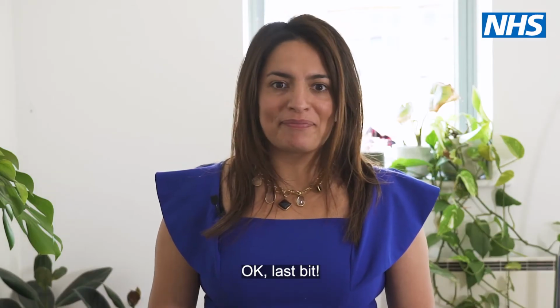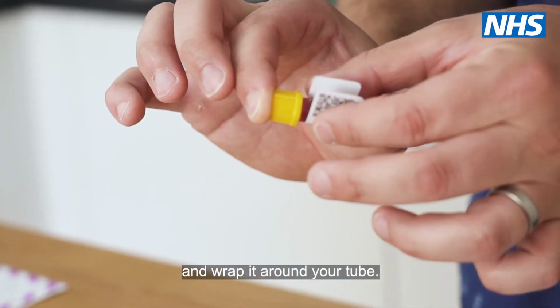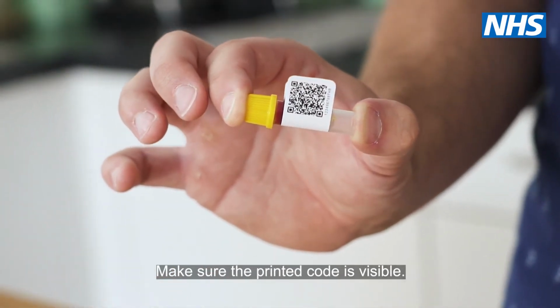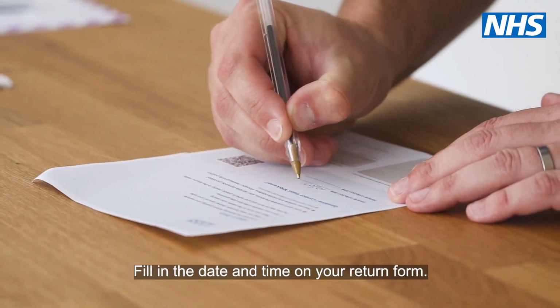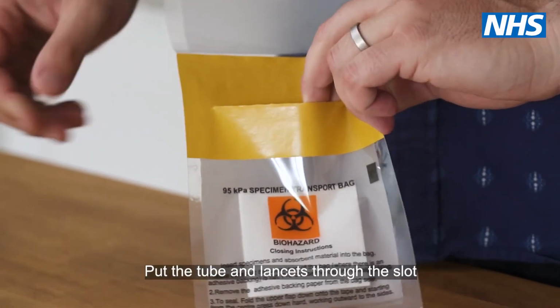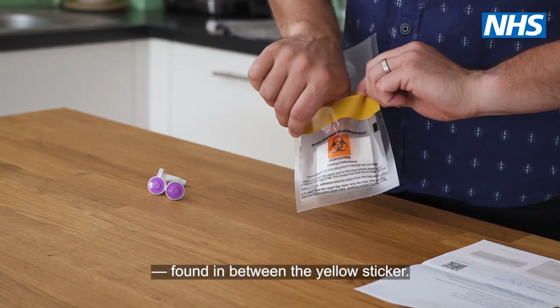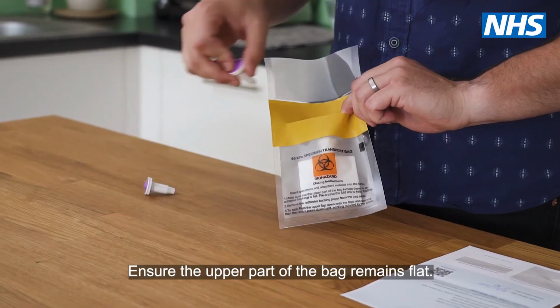Okay, last bit. Peel your tube label from the returns form and wrap it around the tube. Make sure the printed code is visible. Fill in the date and time on your return form. Get the clear plastic bag labelled 95 kPa specimen transport. Put the tube and lancet through the slot found in between the yellow sticker. Ensure the upper part of the bag remains flat.